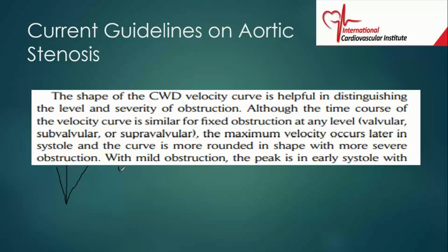If you get a rounded peak like this, then this usually suggests a more significant obstruction. If the obstruction is even more, then the peak will come even later.